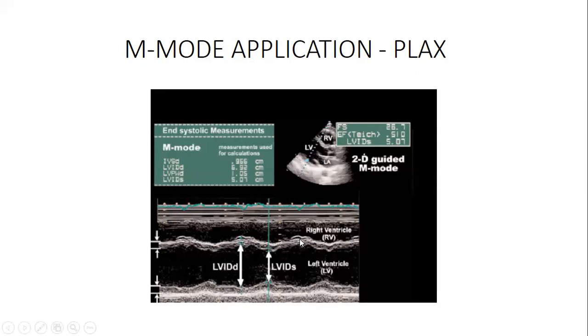For argument's sake, when the septum thickens it comes up to here, and the posterior wall also thickens up to there. Because of the bulkiness of the muscle mass, it will reduce the cavity. Do you agree?